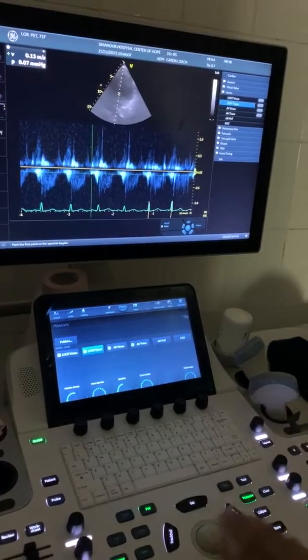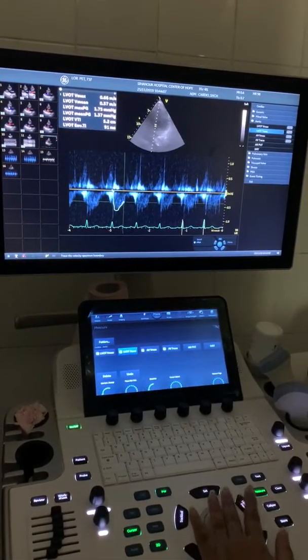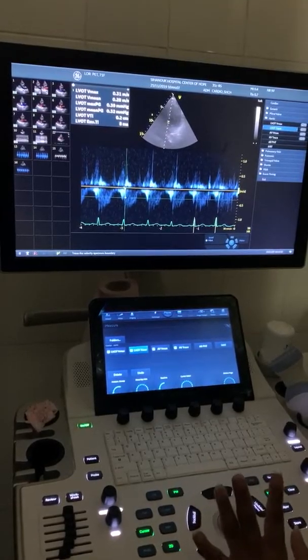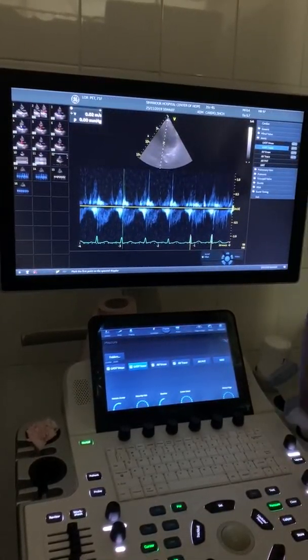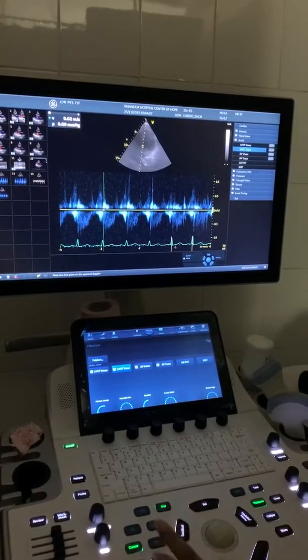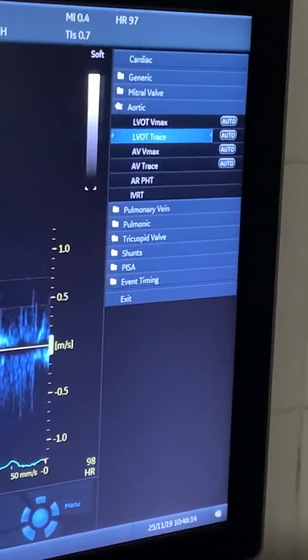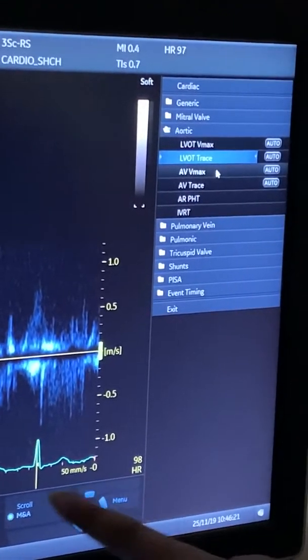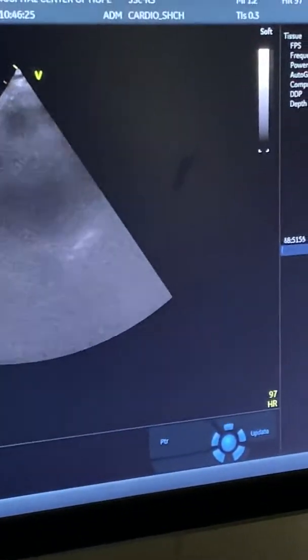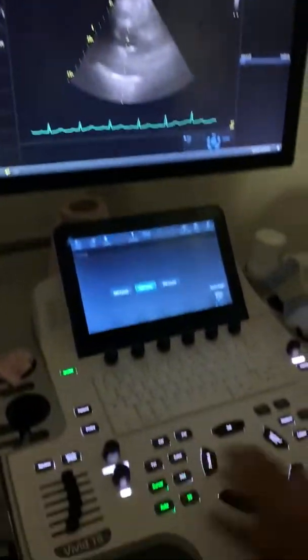By the way, I'm not sure if you're familiar - manual like this, you go like this, and if you don't like it you just go back. Now at least you know you can do that. So you got A/S - it's the same as in mitral valve, doctor. Usually we're doing it like that. This is PW, just a different way.